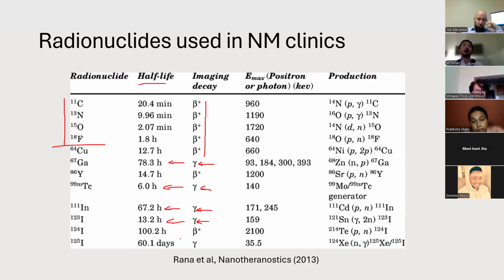So it's a longer half-life, right? Whereas for the PET, FDG, the workhorse of the PET, is 2 hours, but the rest are very short-lived. So these pose a logistical challenge, because when it decays so fast, when you transport them, if it's produced remotely, you have to start with a very high activity and it poses radiation risk, right? So the PET is harder in terms of logistics because of that.